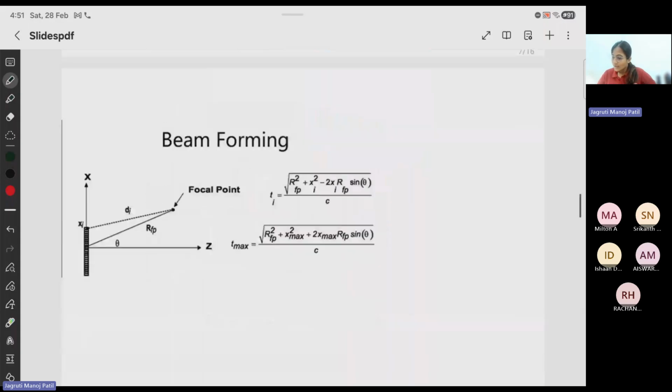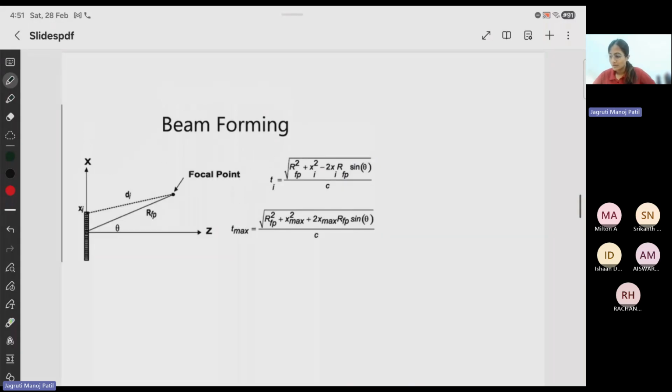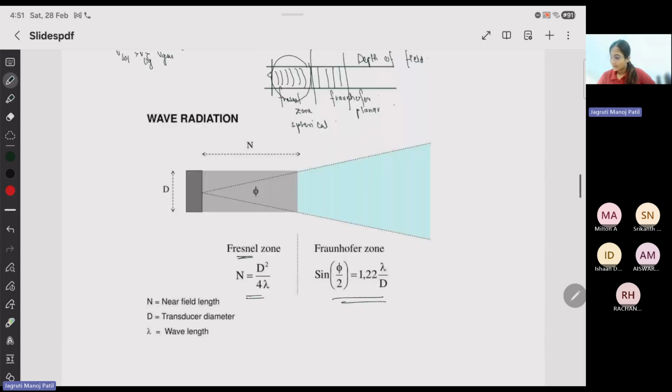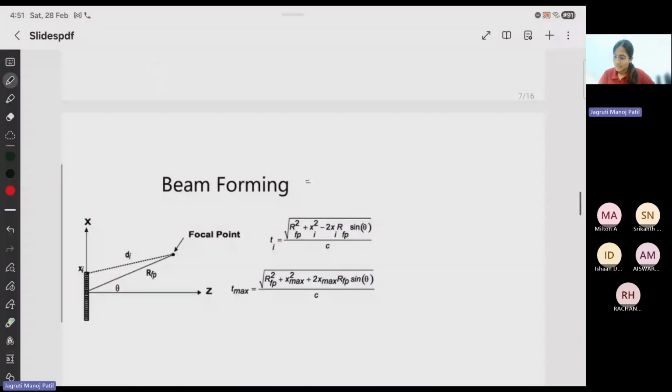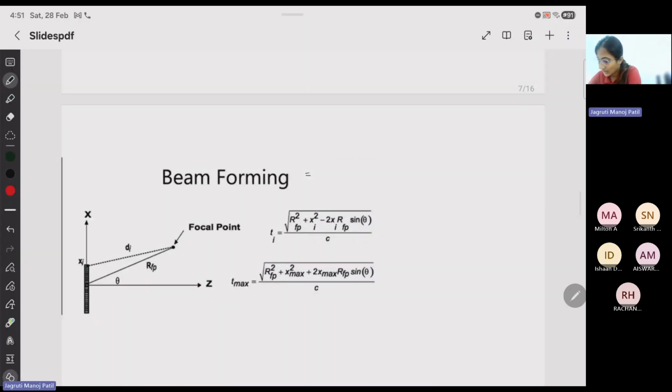Okay. Then you had this beam forming. Now, what is beam forming? We looked here at an array of transducers. Let's just make a transducer here. You are sending from the first element, then receiving it back, again sending, receiving back. To make a complete image, if you do this one by one, your resolution is very poor. You won't be able to reconstruct the entire image in a form where you are correlating each pixel towards your tissue scattering or cellular scattering.